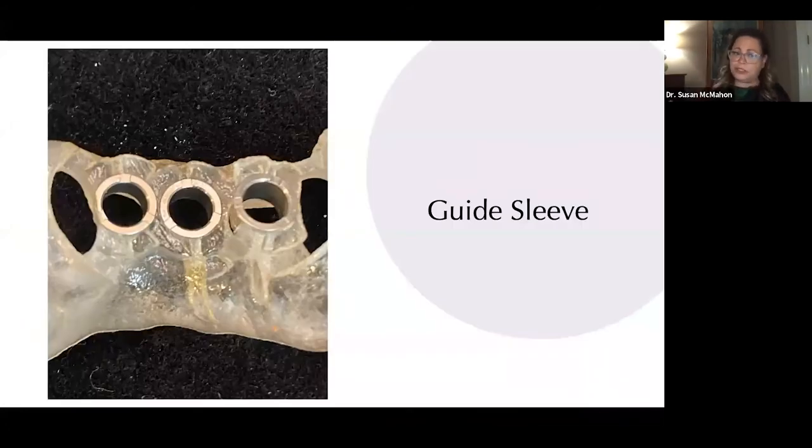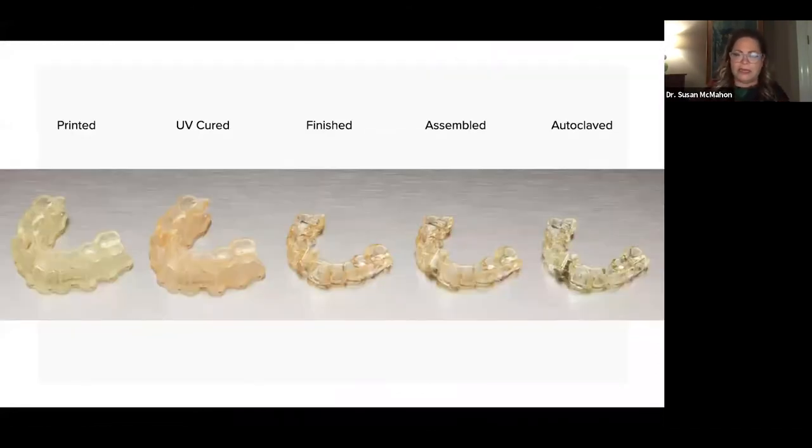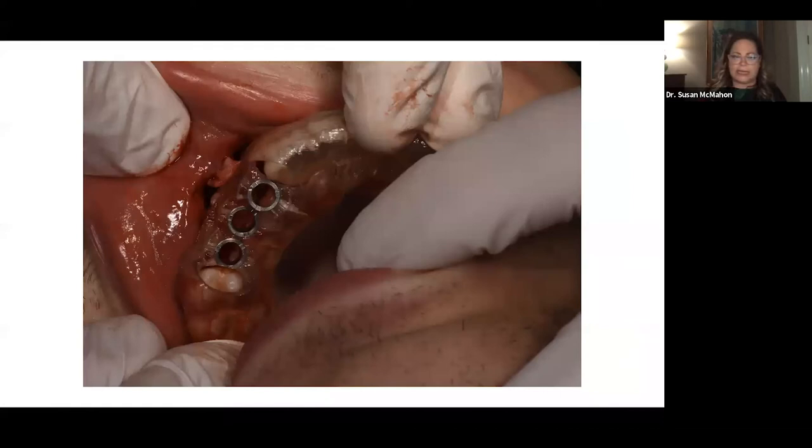We can purchase guide sleeves from whatever implant company you're using. So these guide sleeves fit right into this designed guide. And that allows the surgeon or whoever's placing them to put the drills exactly in the right orientation and only to the right depth. So it only allows an exact placement. So we print it, we cure it, we finish it, we assemble it, and then we autoclave it. So you clean it before you take it to the patient.